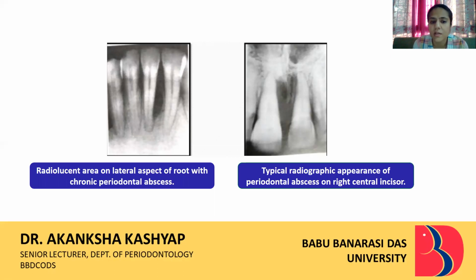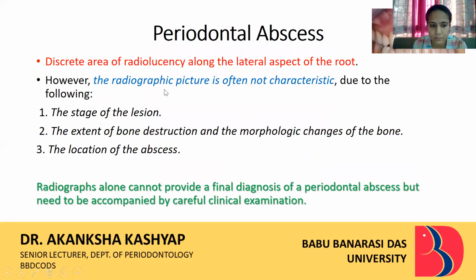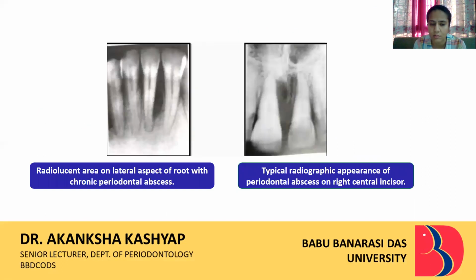And if the destructive lesion is in the buccal or the lingual bone, then also it is very difficult to appreciate on a radiograph. But if the lesion involves the interdental bone, then it can be clearly visible on the radiograph. So radiographs alone cannot provide a final diagnosis of a periodontal abscess, but they need to be accompanied by careful clinical examination.